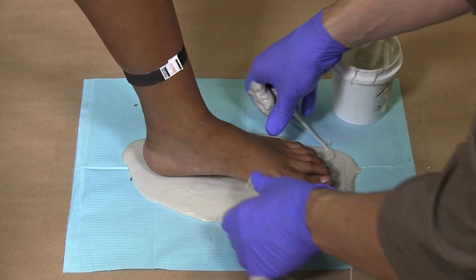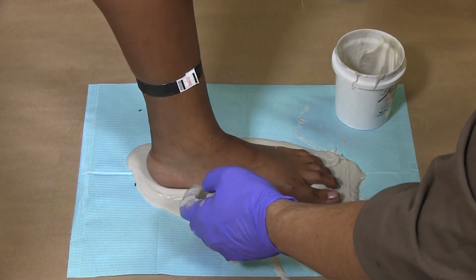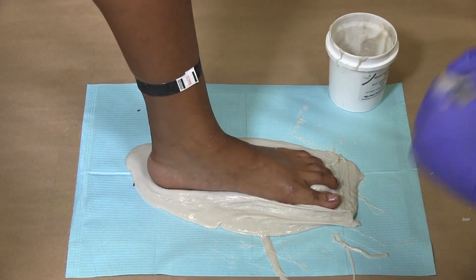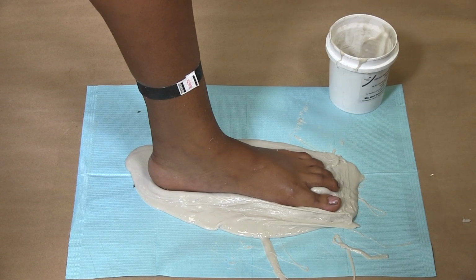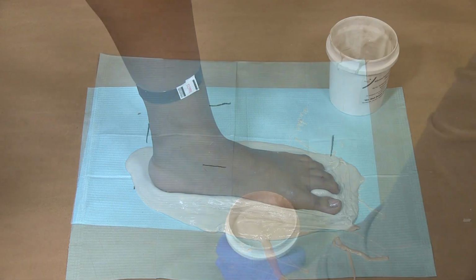With the impression material tacky, have the customer place his or her foot firmly and flatly in the impression material. Make sure the ankle is at a 90-degree right angle with the leg vertically straight. The toes should be relaxed and in a comfortable position, not splayed or strained in any way.